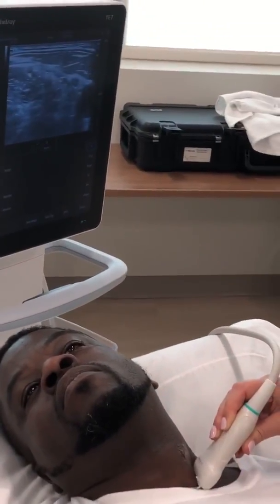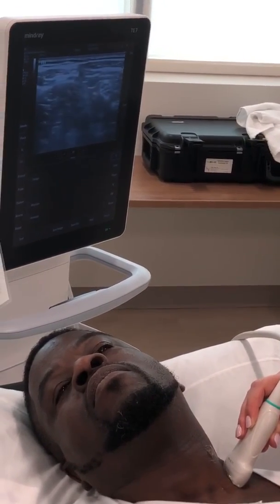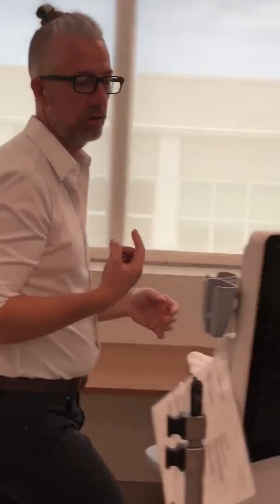So if you point upwards, that would be the artery, because the flow of the artery is going up. If you put it down, you see it all comes towards you. If you go up, it'll be blue. Okay, so it's going to be flow direction.